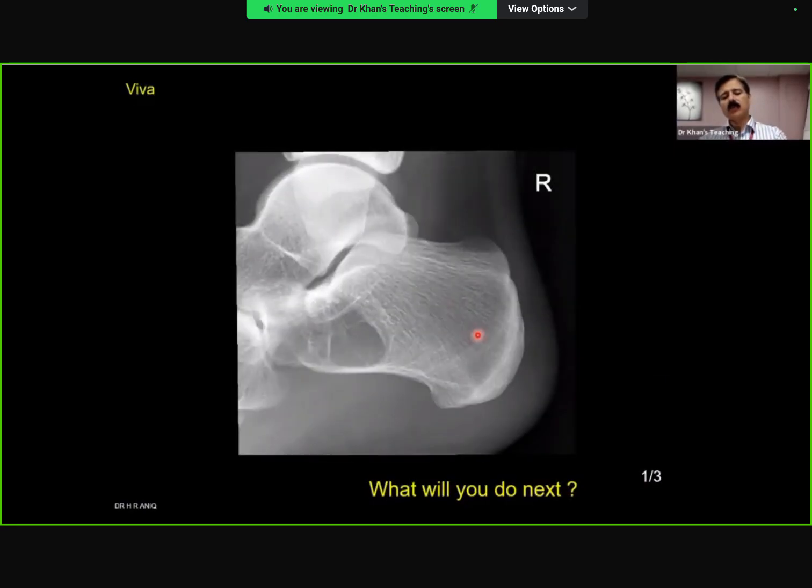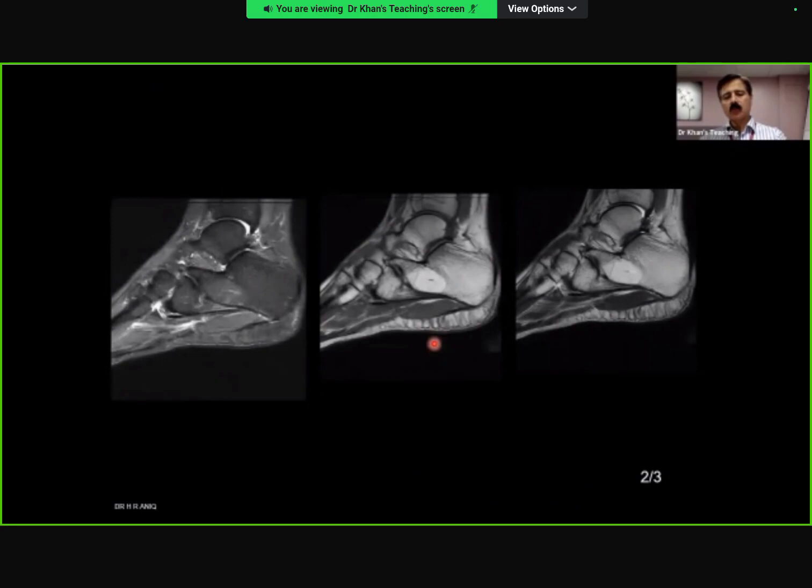Now, please remember that calcaneal lesions per se have a differential diagnosis that changes according to age. So we have already covered lipoma, simple bone cyst, giant cell tumor, and then hemophilic pseudotumor, brown tumor. All of these can come in the differential diagnosis. Hemophilic pseudotumor in the calcaneum has come up in the exam. It's quite a favorite site. I'll show you next time.